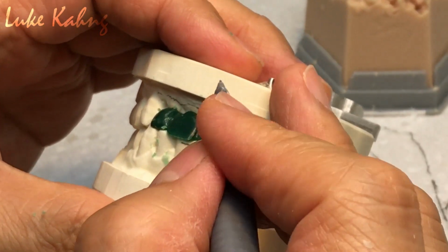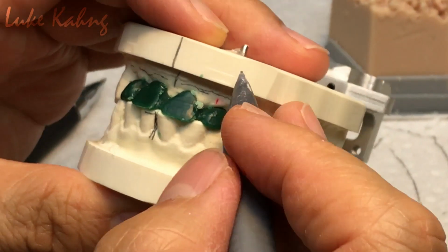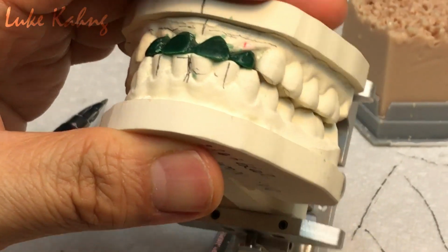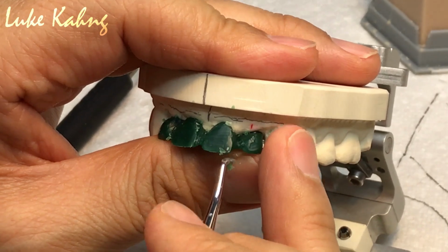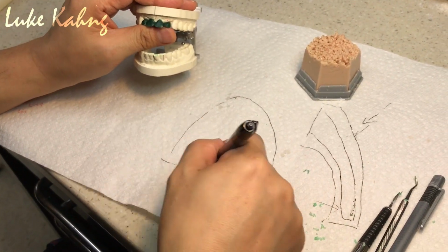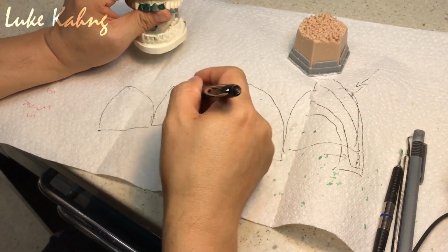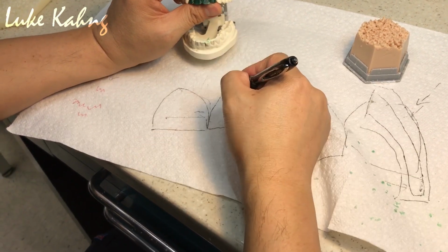Second, I have to write down the middle line. Unfortunately, I do not have a face bow, but like I said, you have to draw the same. Now it is too big, so I have to move here. Meaning, I have to cut it this much. Make sense? Right. So whenever I draw here, if central is too big, lateral is small. Sorry, I have to draw here a little bit bigger. You cannot make this as big. So I have to bring it in, which is what I did. Now this lateral has to come in more easily.